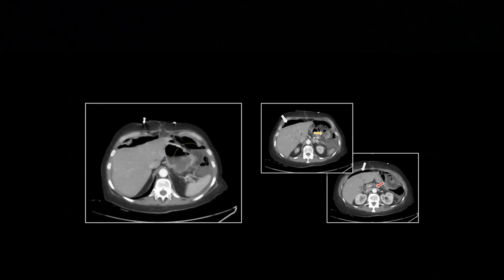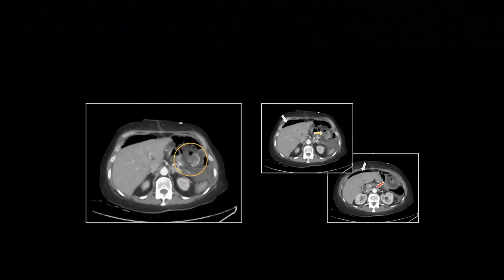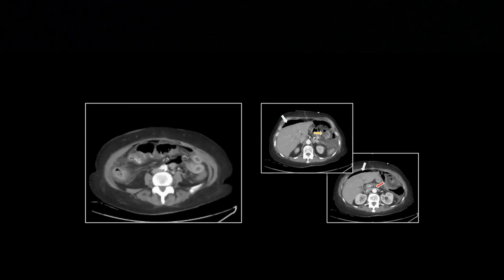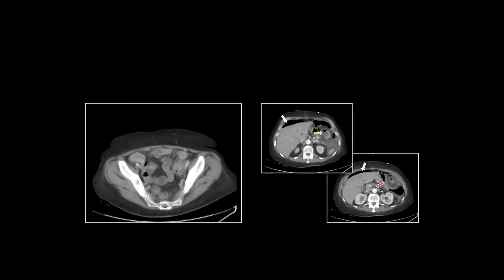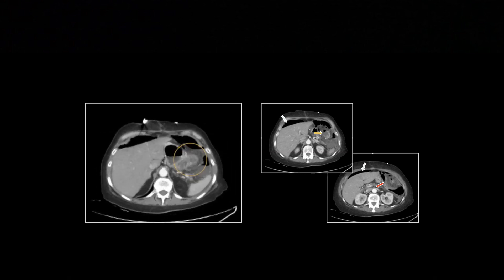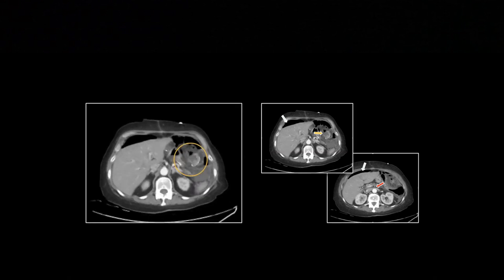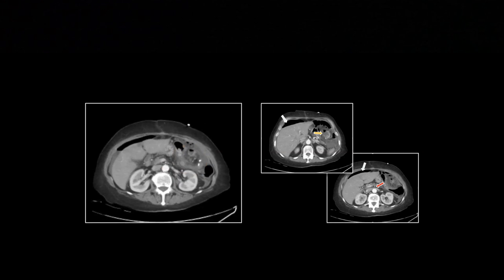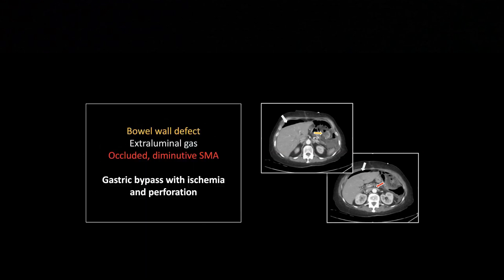Let's pick up this SMA. It is incredibly small, but right there you can see it is not enhancing, right in front of the renal vein. This was a case of ischemia — there is the perforation, and you can see that tiny SMA is, in fact, occluded.